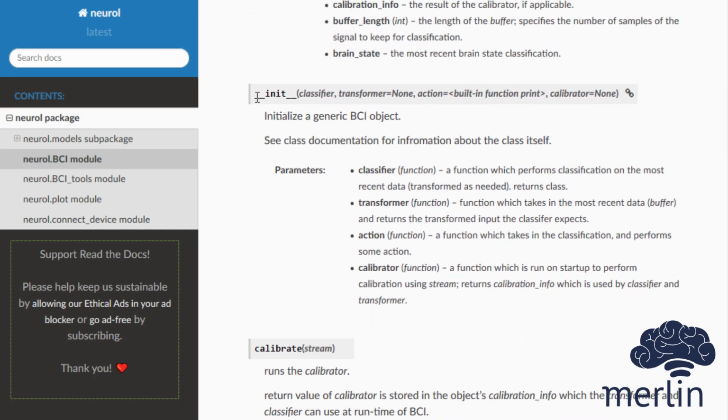First, an optional calibrator, which runs at startup and can provide useful user calibration information to the transformer and classifier. Then we can provide an optional transformer, which transforms the newest buffer of data into the form that's expected by the classifier. We often use this to convert to the frequency domain. Of course, we need a classifier, which decodes the data into some classification of brain states. And finally, we provide an action function, which provides feedback in response to the decoded brain state. Once these functions are defined, we only need a stream of data and the BCI can be run.